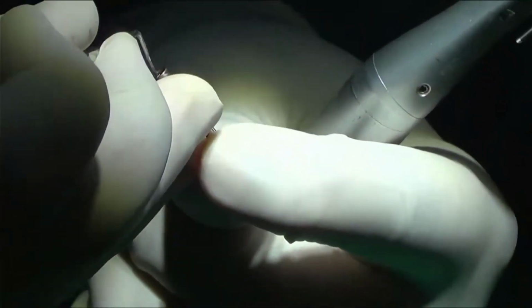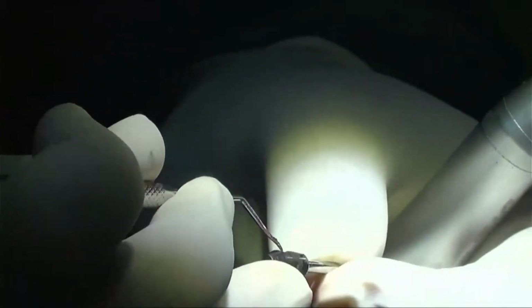Your histoacryl is basically your tissue adhesive that you can use for your dressing. It's a cyanoacrylate, basically medical grade cyanoacrylate.